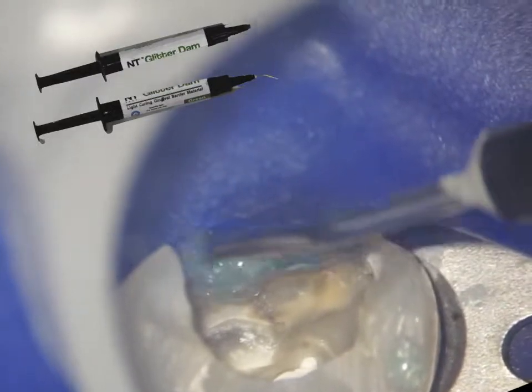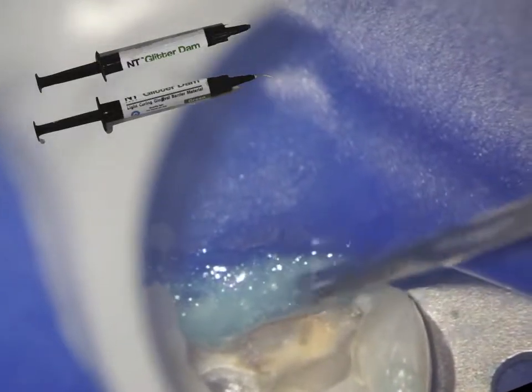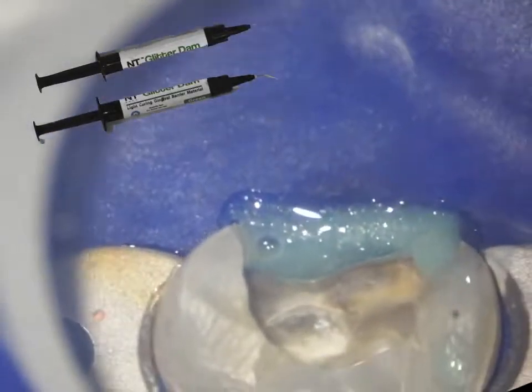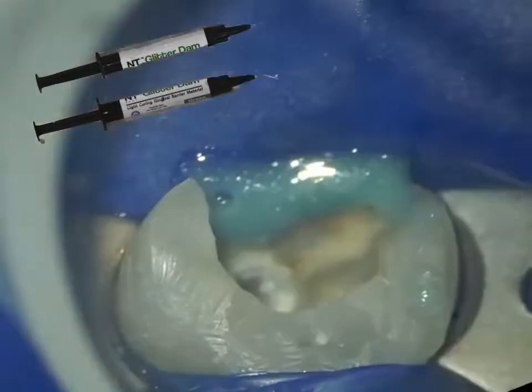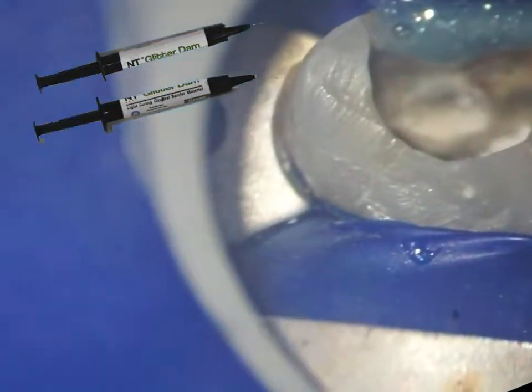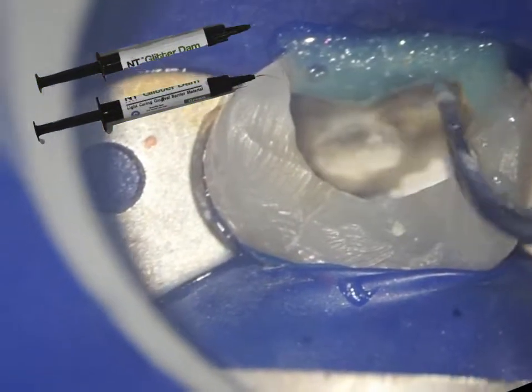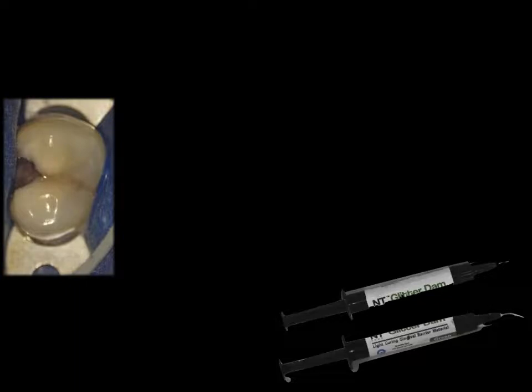This prevents any kind of hypochlorite extrusion or salivary ingress into the cavity during our cleaning and shaping process. It's a fairly easy-to-extrude material that comes in a syringe with a tip. All such materials are almost flowable in nature, having a decent viscosity, and are light curable. Once adaptation is done, all we have to do is cure it with a proper light and we have a ready wall — a fourth wall — preventing any ingress of saliva or outflow of sodium hypochlorite.